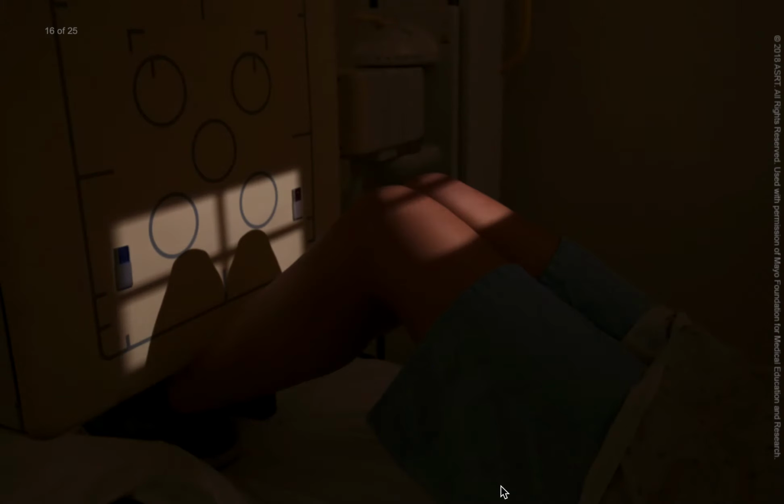If a designated support device is not available, a tabletop image receptor holder can be used, and a similar patient position is achieved with the patient lying supine. Both knees are flexed 40 degrees, with the soles of the feet resting on the radiographic table. Although 40 degrees is common, varying degrees of knee flexion can be used to demonstrate particular disorders of the patellofemoral joint. It is important to note what degree is used so that it can be reproduced in future examinations.